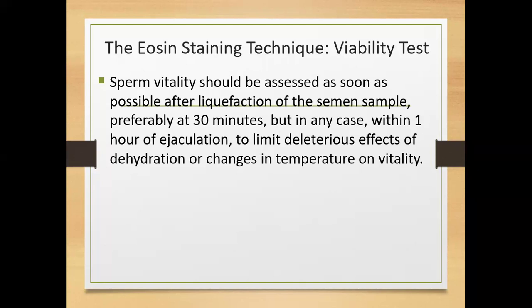The question is, were they dead from the ejaculate? Because if they are dead from ejaculate, that means we are going to look at the epididymis and see whether there is a problem there, maybe an infection, or what is in the epididymis that is killing the sperms. But if you can target the epididymis, it means you yourself know that environmentally, you have not caused them to die.